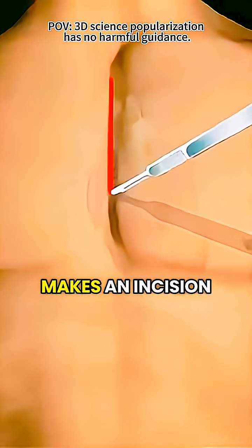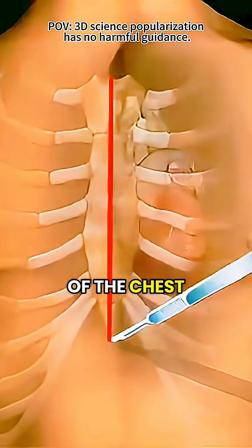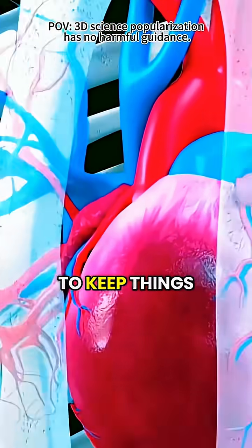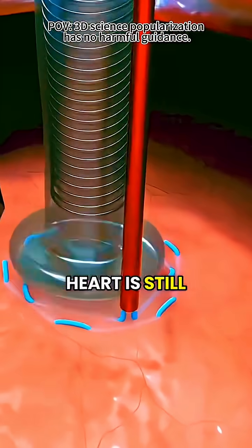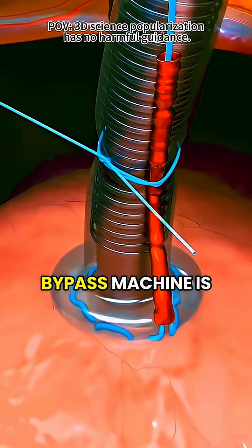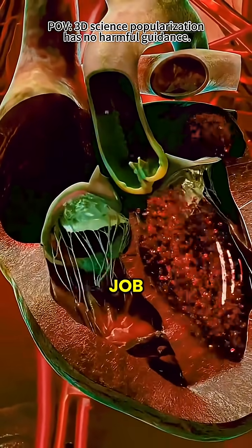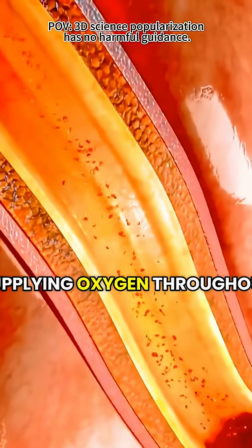Next, the surgeon makes an incision down the center of the chest and gently separates the breastbone to get full access to the heart. To keep things safe while the heart is still, a machine called a heart-lung bypass machine is used. It temporarily takes over the heart's job, pumping blood and supplying oxygen throughout the body.